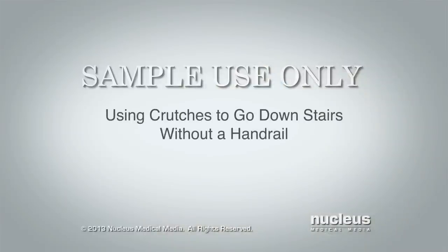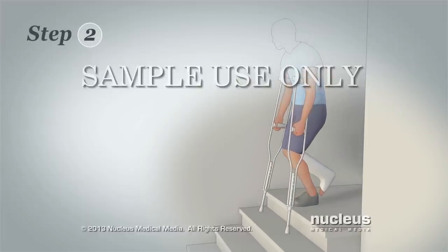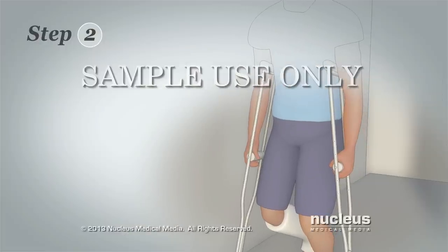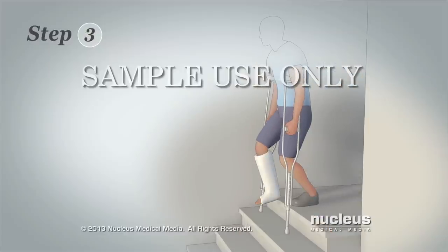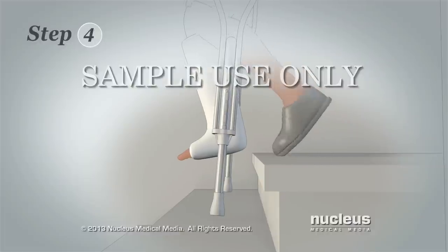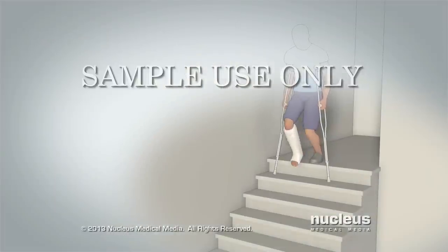Here's how to go downstairs without a handrail. Step 1: Begin as close to the stairs as possible. Keep one crutch under each arm. Step 2: Lean forward and place your crutches in the middle of the step below you, then lean your weight on the hand grips of your crutches. Step 3: Move your injured leg forward slightly. Step 4: With your uninjured leg, step down onto the next stair step. Repeat this process for each stair step.